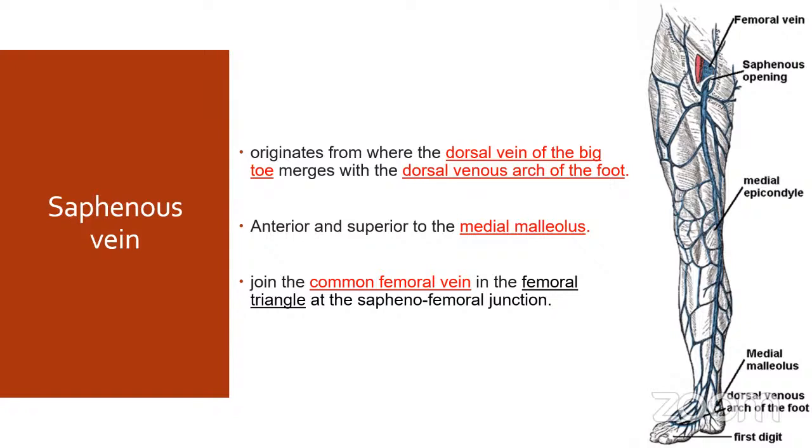By the way, it's a contraindication to use varicose veins if you see any. If during your dissection as you go on you see the vein suddenly become very small, the big thing is to ask yourself why. And that usually can get you the answer. Many times you have a deeper branch that is probably the proper longer saphenous vein, but you have missed it and you went for a smaller superficial branch. So if you go back again, retrograde a little bit, and start to dissect into that area, that will be better.